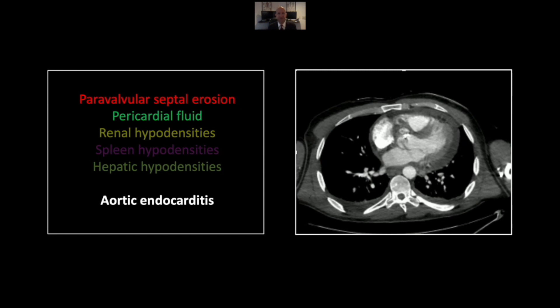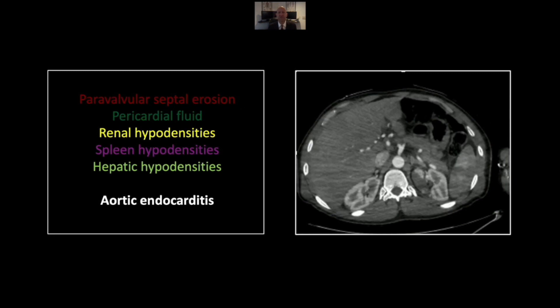Our next case is aortic endocarditis. This manifests as a paravalvular erosion or contrast collection in the upper septum in the region of the AV node, which explains why many of these patients present with heart block. This is a common location for a ring abscess — a complication of aortic endocarditis. Note also a significant pericardial fluid collection, which in this case represents a piopericardium. In the abdomen there is evidence of embolic phenomena in the kidneys, the spleen, and even the liver, consistent with an arterial embolic shower.